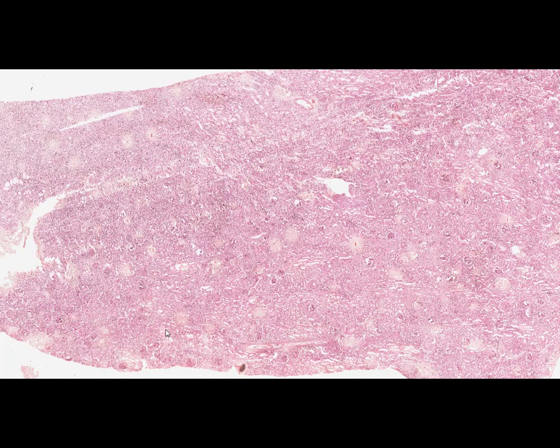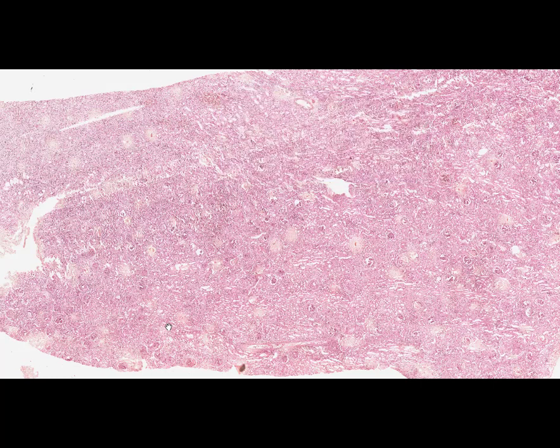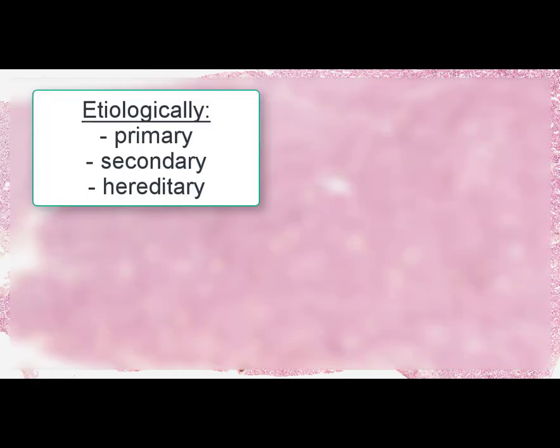On this slide we can see a kidney, stained by hematoxylin and eosin. The name of this slide is extracapillary proliferative glomerulonephritis. By definition, glomerulonephritis is a bilateral diffuse or focal non-purulent inflammation of the renal glomeruli resulting in renal or extra-renal manifestations. There are few types of glomerulonephritis according to etiology.